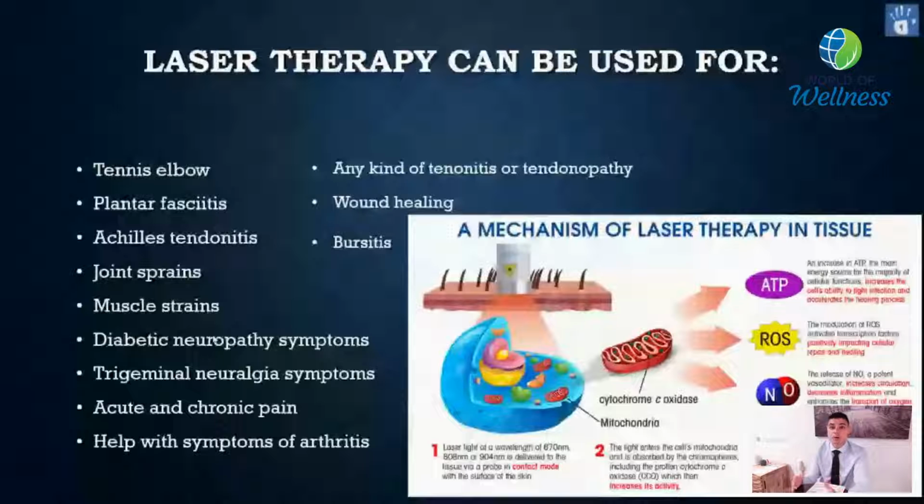and then it'll actually help with the symptoms of your diabetic neuropathy, again, because we are turning open the calcium ion channels in your feet so you just feel more comfortable in your skin, and we're trying to create the connection from your brain to your foot, so you don't feel the numbness in your foot as much.